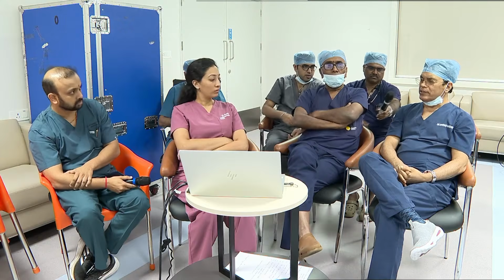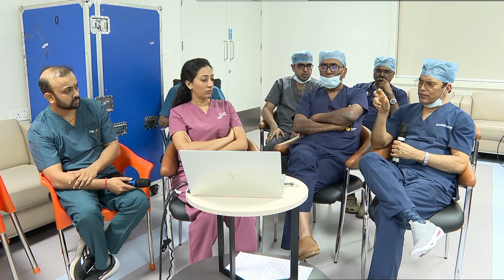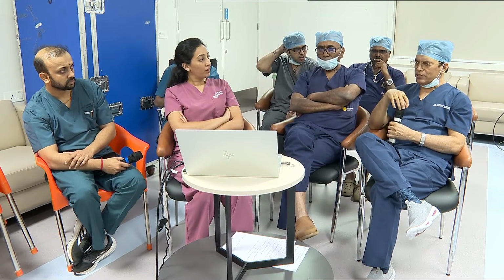Longevity was shown in the trial, and the average showed 8 to 9 years. That's the reason the average lifespan of a bioprosthetic valve is said to be 10 to 12 years. So you put the bioprosthetic valve, 10 to 12 years, then another one. Somebody just mentioned that if you are putting valve in valve, two self-expanders is hazardous because of more overlap of mesh. If you are going for valve in valve, the first valve should be balloon expandable. It will last 10 to 12 years. After that you can put a self-expanding valve, extending another 10 to 12 years.